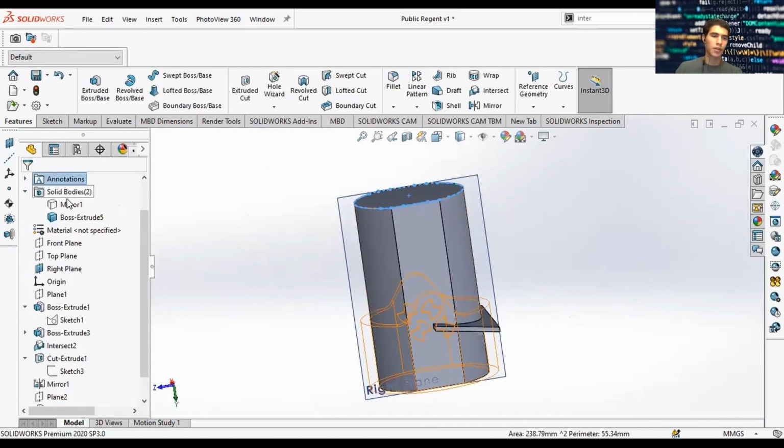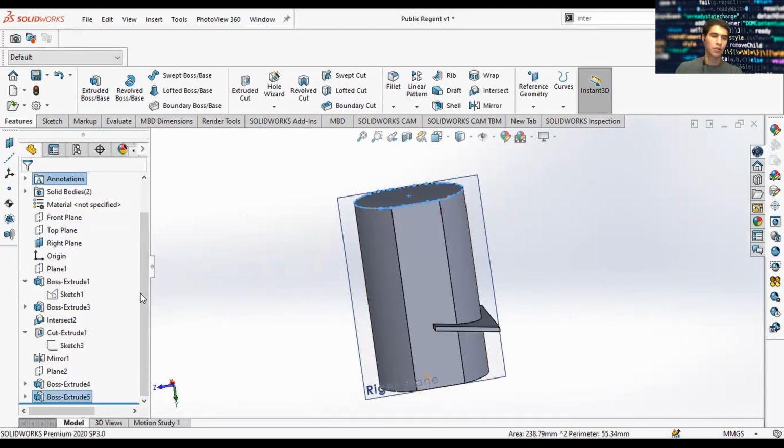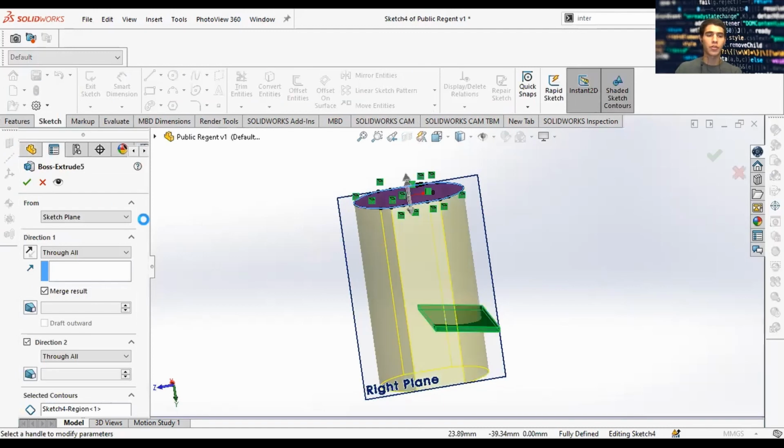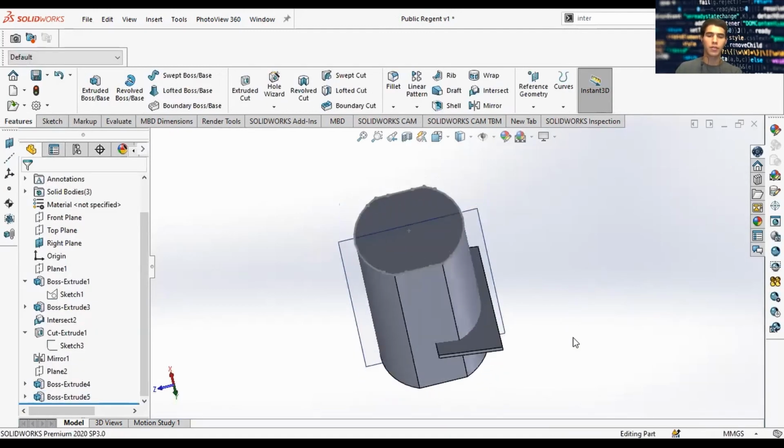And right now you notice this has 2 solid bodies. We want to have 3 solid bodies. So probably here, edit feature, we need to correct for merge result. So unclick merge result, and now it should be 3 solid bodies, because now we can do intersect.